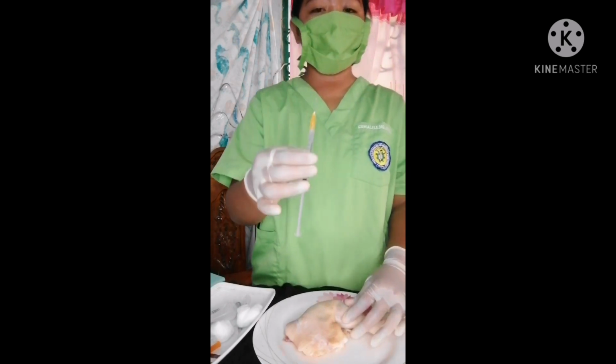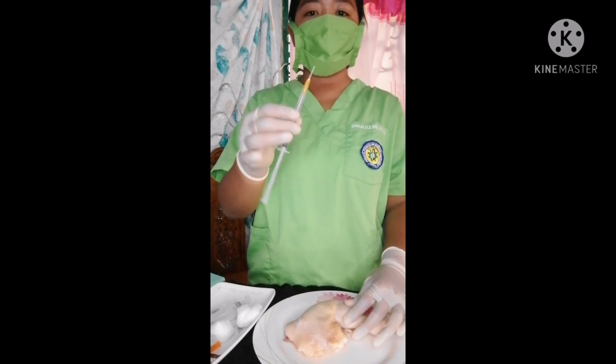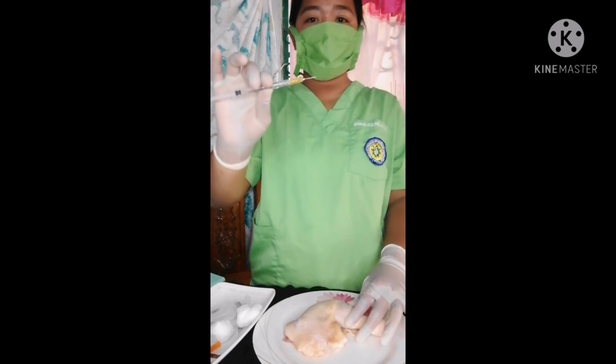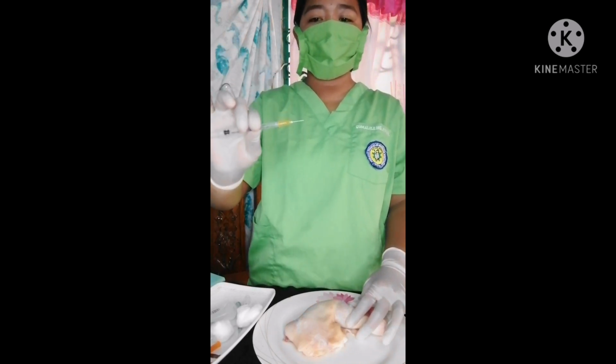Hold the syringe in the dominant hand between the thumb and forefinger with the bevel of the needle up. Hold the syringe at a 10 to 15 degree angle from the site and place the needle almost flat against the skin of the patient, bevel side up.